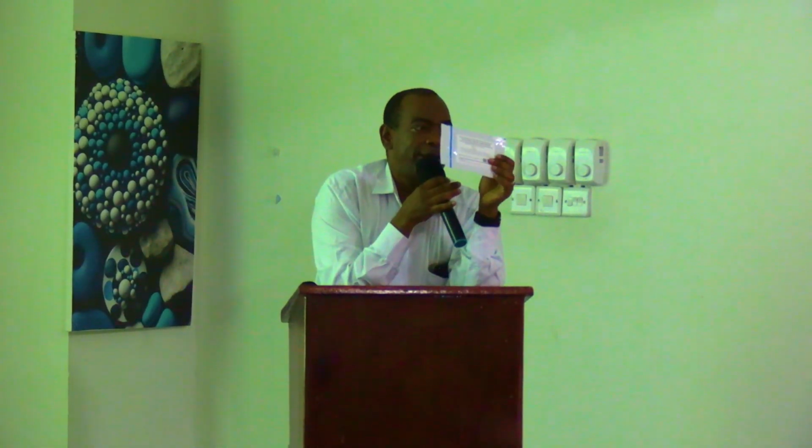So we have a system check cartridge. When we are delivering your equipment, we always come with this. It is not a routine thing, but we normally deliver with this, and we will look at it. So this is the system check, and it comes with an ID chip inside, also indicated system check.